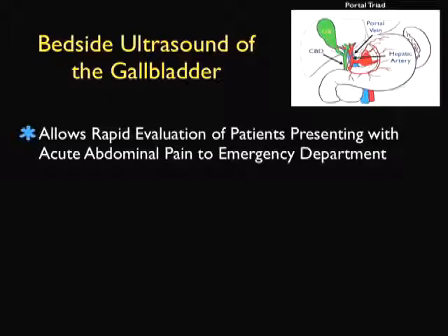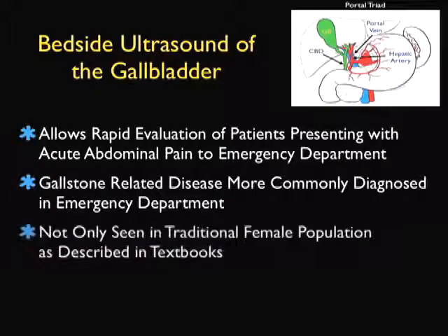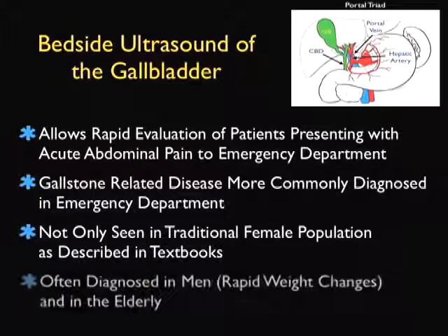Bedside ultrasound of the gallbladder allows rapid evaluation of patients presenting with acute abdominal pain to the emergency department, and gallstone-related disease is now more commonly diagnosed in the ED, secondary to the increased use of ultrasound scanning at the bedside. Interestingly enough, gallstone-related disease is not only seen in the traditional female population as described in textbooks. As we start to look more and more with bedside ultrasound, we're often diagnosing gallstone-related disease in men who have rapid weight changes and in the elderly.